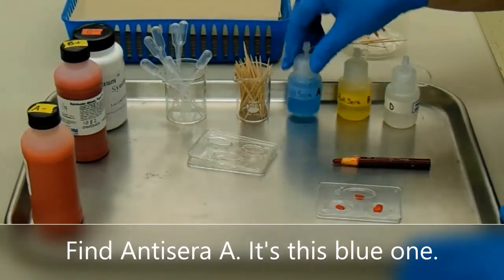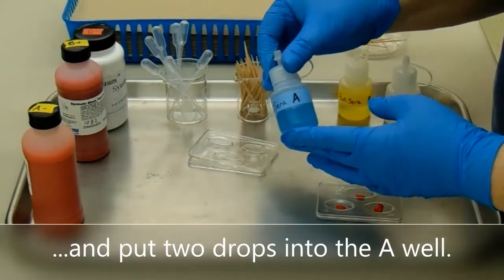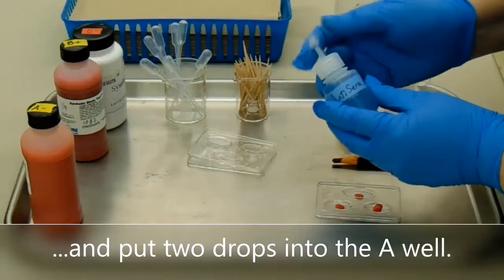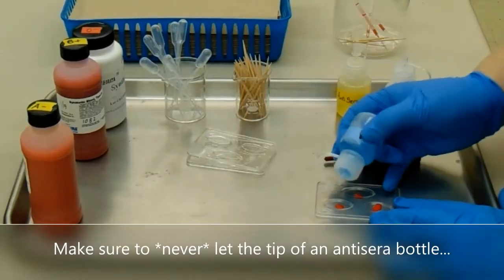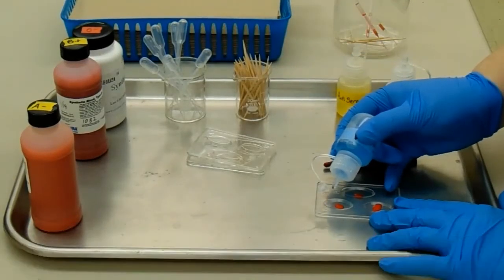Find antisera A, it's this blue one, and put two drops into the A well. Make sure to never let the tip of an antisera bottle touch the blood drop.